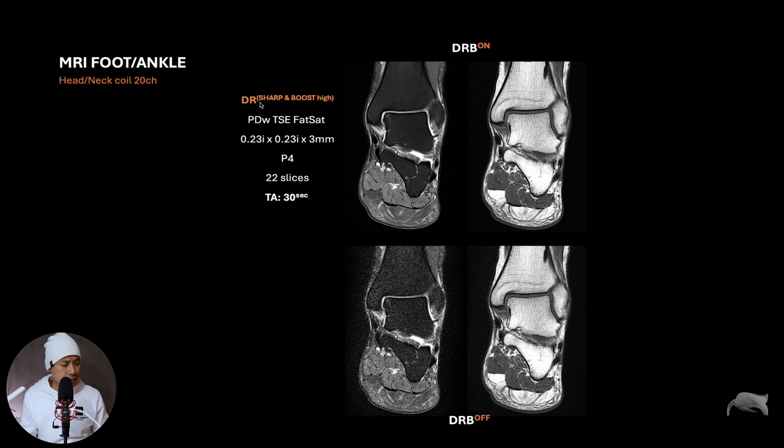Looking at the parameters: we're using the Deep Resolve Boost along with the Sharp and High settings. This is a PD-weighted sequence with spectral fat saturation — very homogeneous, which I noticed. The resolution is high and we're going with a high acceleration factor of PAT 4 to get the scan time down. We're covering 22 slices and this sequence takes only 30 seconds in the head coil — which itself is amazing.